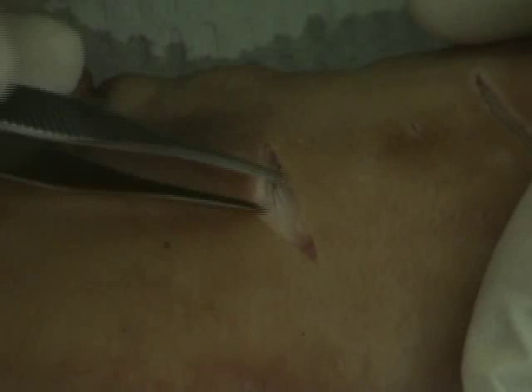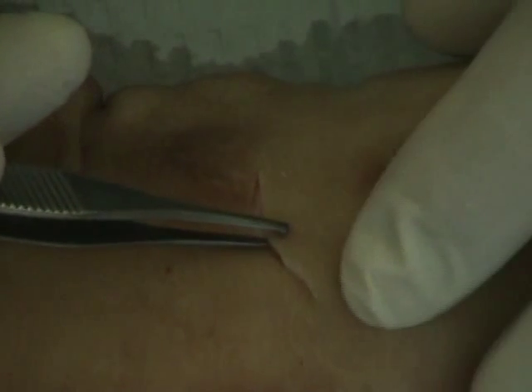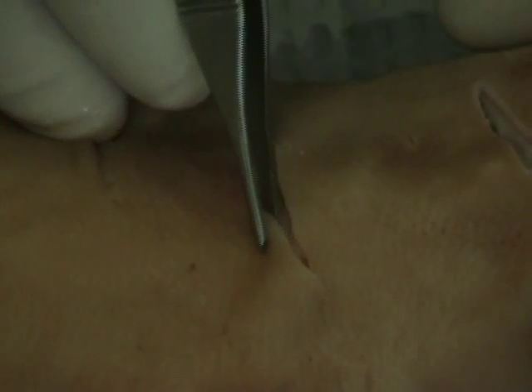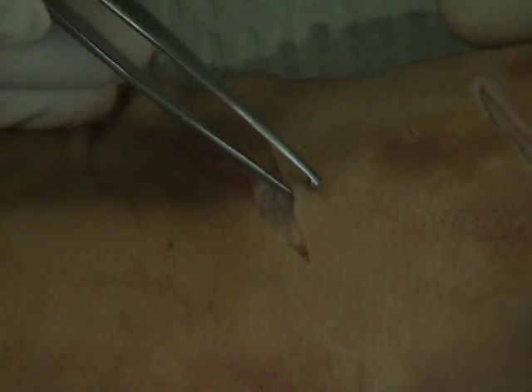Because if I pull the skin up and I pull off to an angle, you can see I'm developing a dog ear over there. If I pull to this side, I'm going to create another dog ear on this side. Or if I come across with this side, I can create dog ears on this side. So the first stitch on this one is critical.